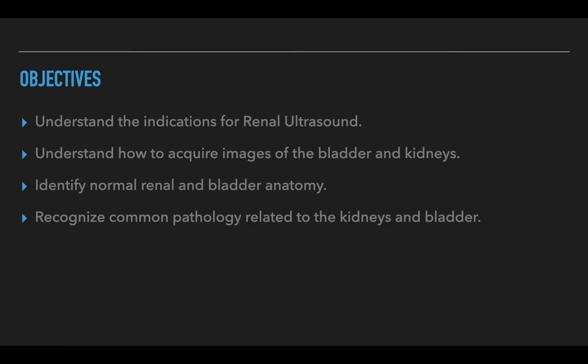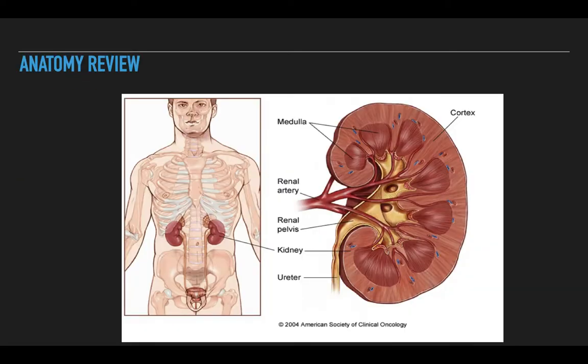The objectives for this talk are you should be able to understand the indications for renal ultrasound. You should understand how to acquire the images of the bladder and the kidneys, be able to identify normal renal and bladder anatomy, as well as recognize the common pathology related to the kidneys and bladder.